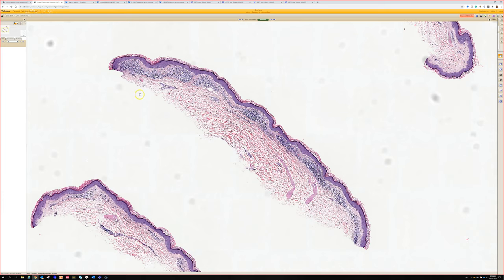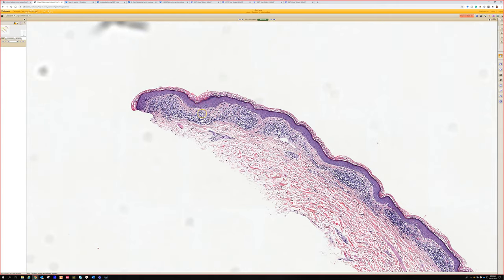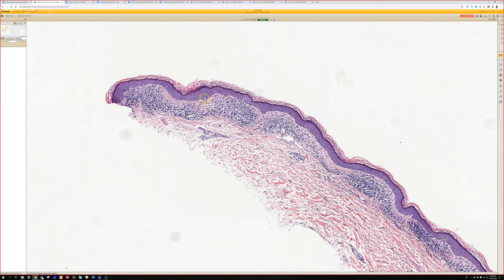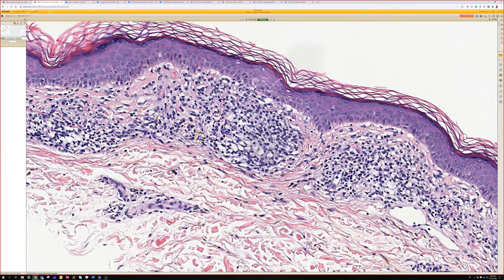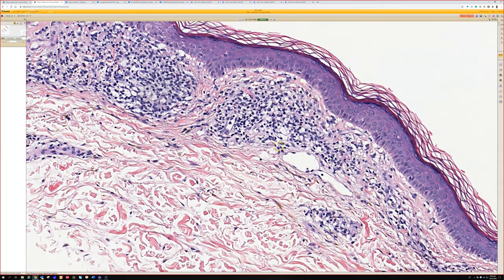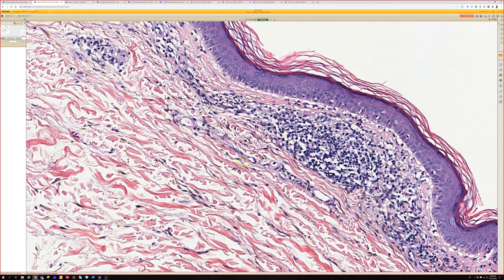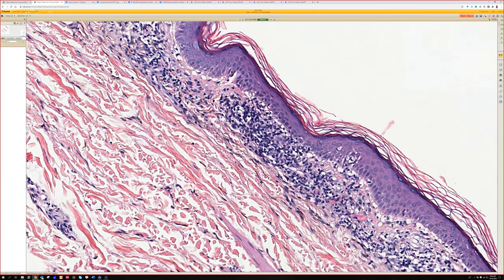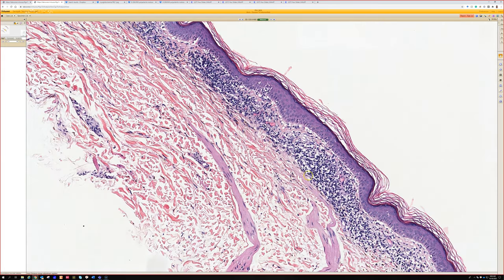Closer up, you can see that there is pigment. Consider the pigmented purpuric dermatosis. Yes — exactly. In real life without any history, I would think of a lichenoid dermatitis or lichen keratosis first because it does look band-like here. But when we get closer, you can see the lymphocytes are kind of localized in little nodules around the vessels. Because I know what it is, I can say yes, you can clearly see it — but in real life it would be harder to pick up on.